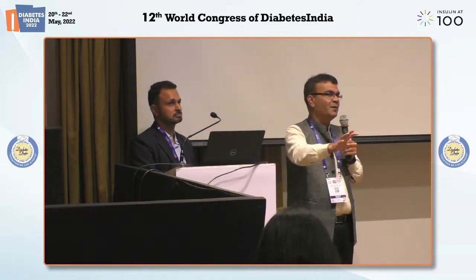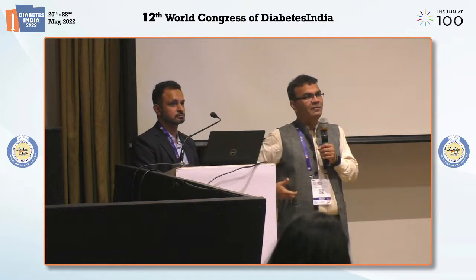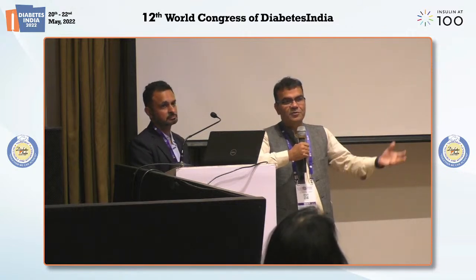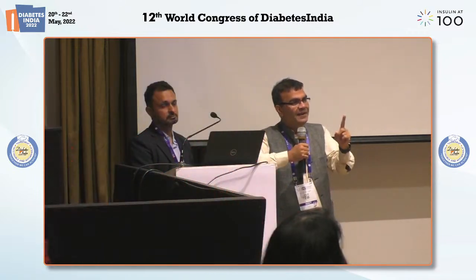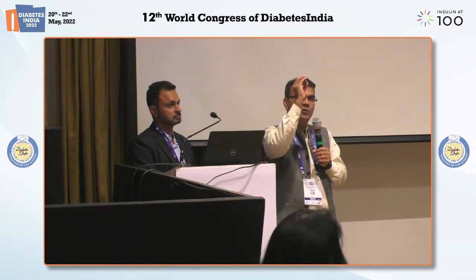You sit with their parents and relatives, talk to them, educate them, examine their abdomen for lipohypertrophy or any other problems. You educate them about the pump and insulin technique. Once a week, once a month, once in 15 days, but do it on that particular day, and make the complete data as well.